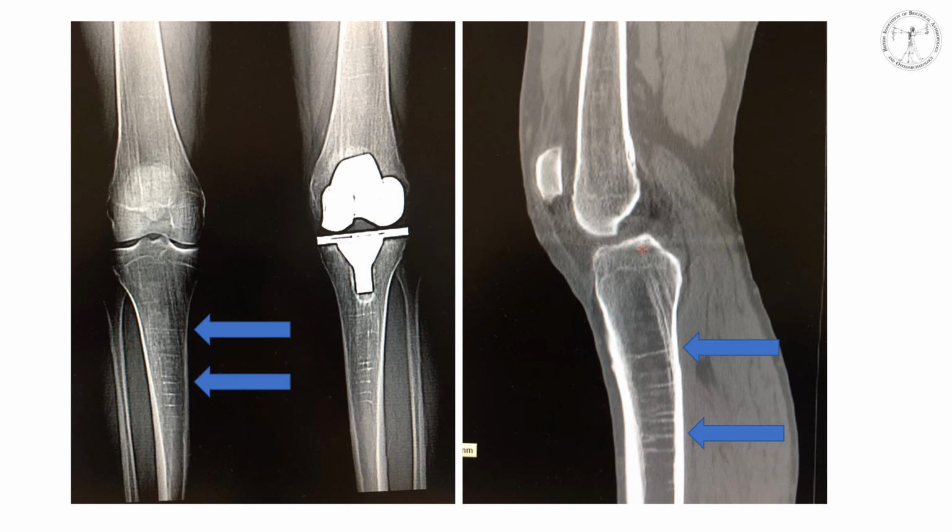Now, this presentation is not so much about her Harris line investigation, but I'd be remiss if I didn't show you an example. This is actually an example, as you can see, from a modern person. Harris lines aren't just of a historical archaeological nature, and we can see these sometimes in patients in practice. The horizontal lines going across for this patient show times where there was a cessation and then the starting again of bone growth, typically seen in long bones.